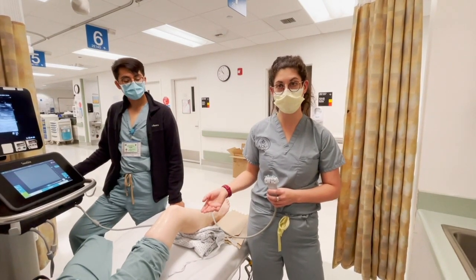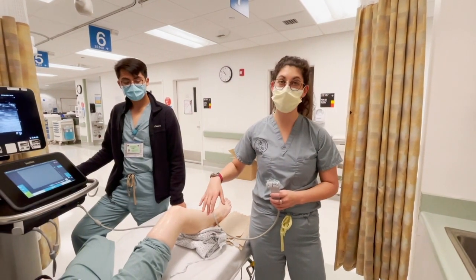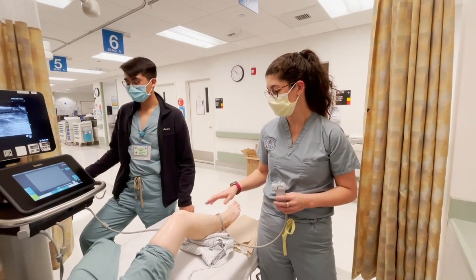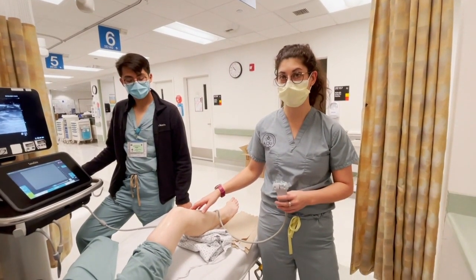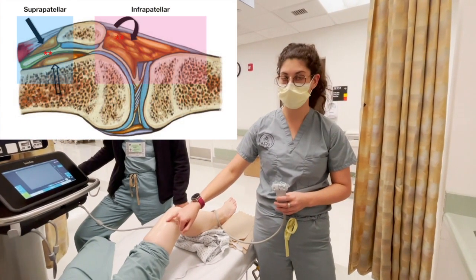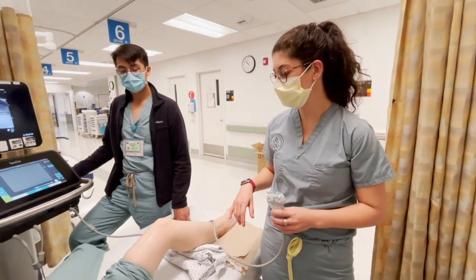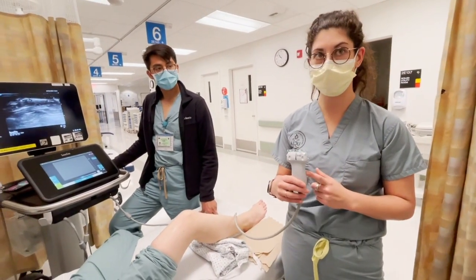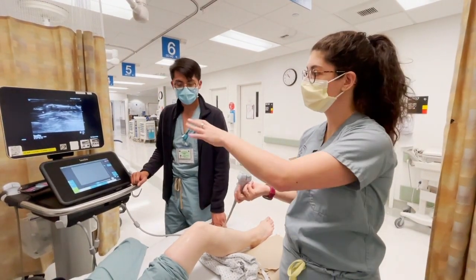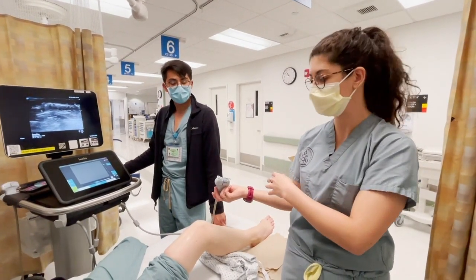We're going to take a look with ultrasound to see if there's any fluid in her joint space. To do that, we're going to start with the knee flexed about 20 to 30 degrees, and we're going to look at two areas: both the suprapatellar area and the infrapatellar area. We're going to use our linear probe with lots of gel, with the indicator dot to the head, so the left side of the screen will be towards the head or hip.